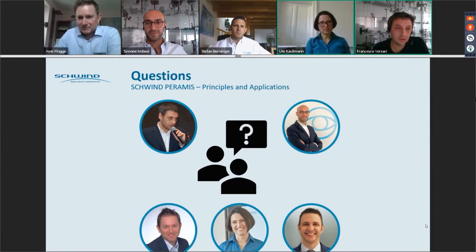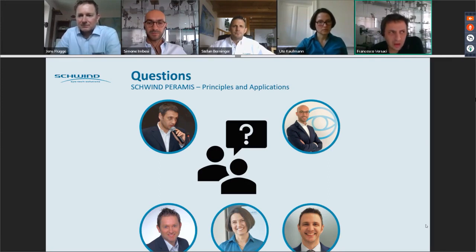What you have to take care of when you acquire keratoconus is that at least the pupil center is reliable, because keratoconus has not straight fixation, so we cannot be sure that the patient is fixating at the same point. So it's a good idea to check the repeatability of the pupil position in the quality summary map. These are tips that I would like to give the user.